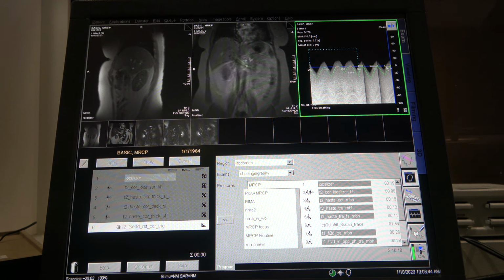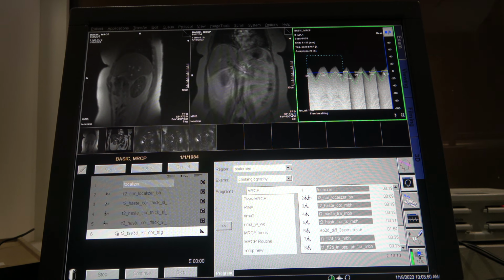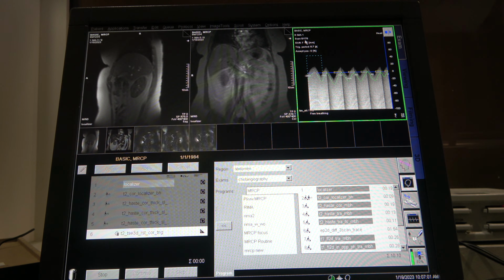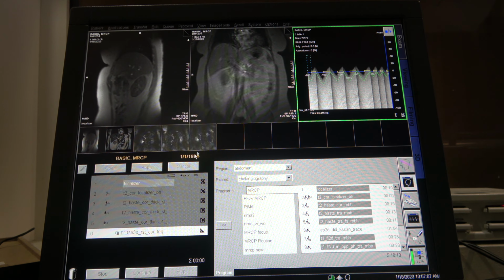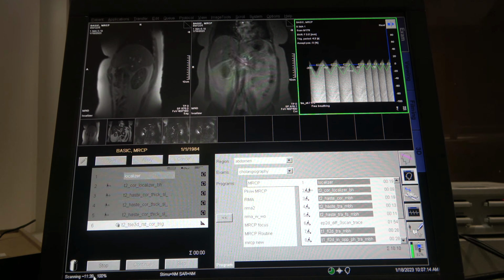Now, if you want this scan to go a little bit faster, you have to instruct the patient before the exam just to breathe nice and normal. And it's going to take 178 pictures. We're barely at number 7. There's an estimated time down here.